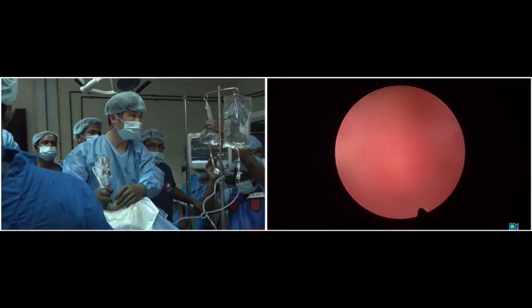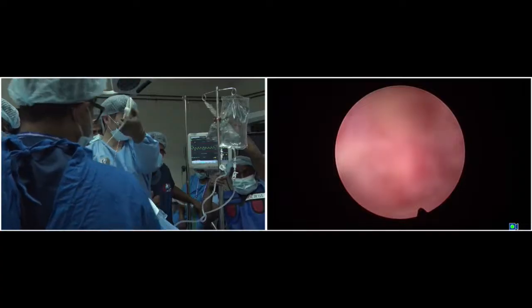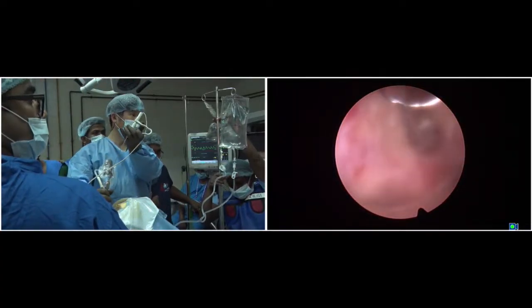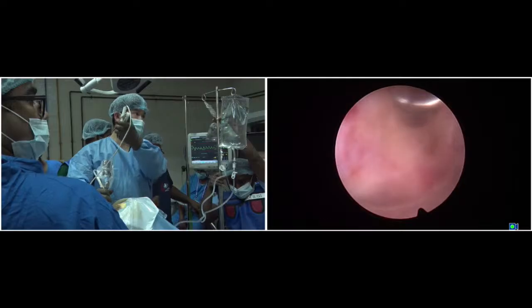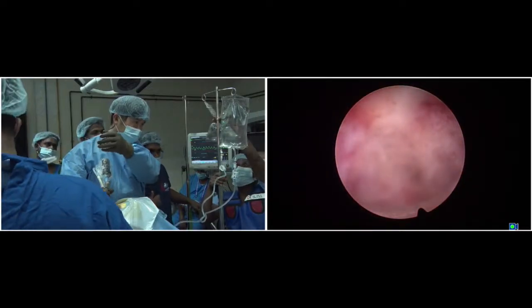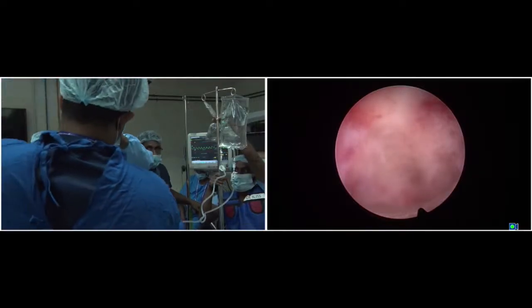RF. Okay, here, pedicle. Okay, I see. Drill. Yeah.